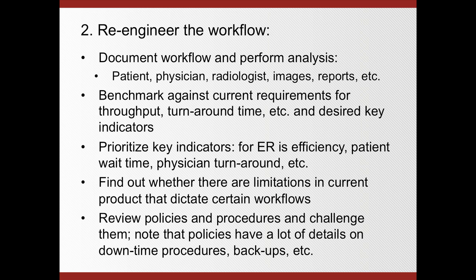Another key important component is finding out whether there are limitations in the current product that dictate certain workflows. The only way to find that out is to do some study or research and talk with some other users. Hey, how do you use your PACS system? How do you use your RIS system? How can we be more efficient than we are? And then take some of the benchmarks as well. There are some benchmarks provided by the AMA and other organizations that say, this is typically the throughput, this is typically the cost, and this is typically how the majority of institutions operate.